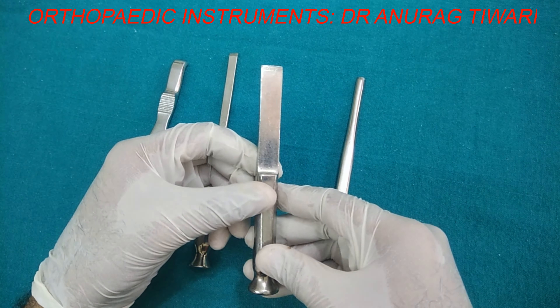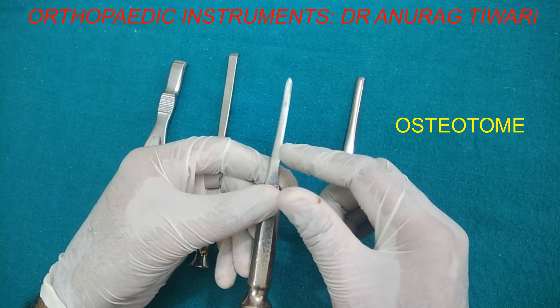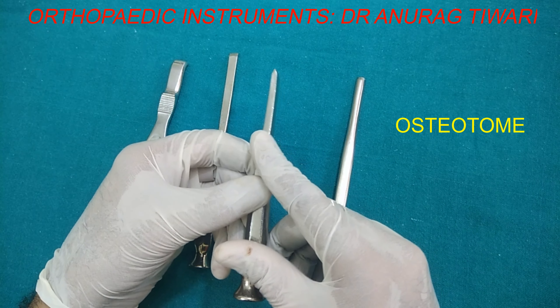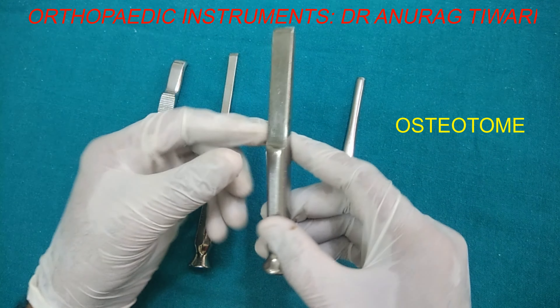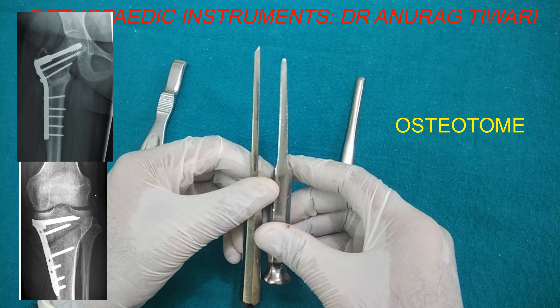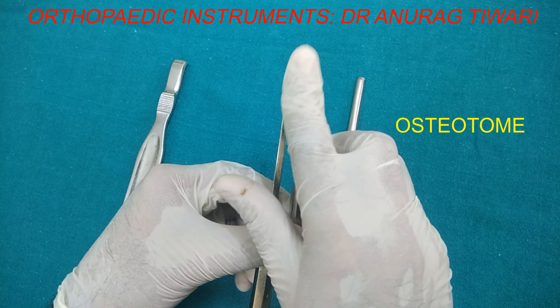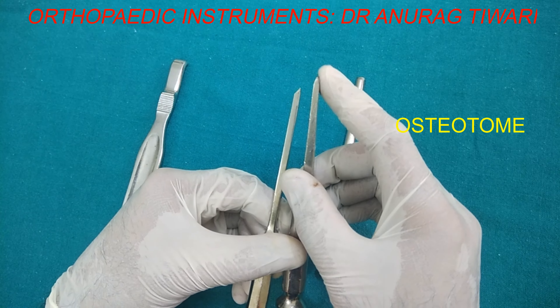Hello friends, myself Dr. Anurag Tiwari. Today I will be discussing the important instruments used in orthopedic surgery. These are most important when it comes to your exams — there will be a different station in the viva where you will be asked about instruments. You must identify the instrument being asked, know its identifying features, and know a few things about the surgery in which it is used.